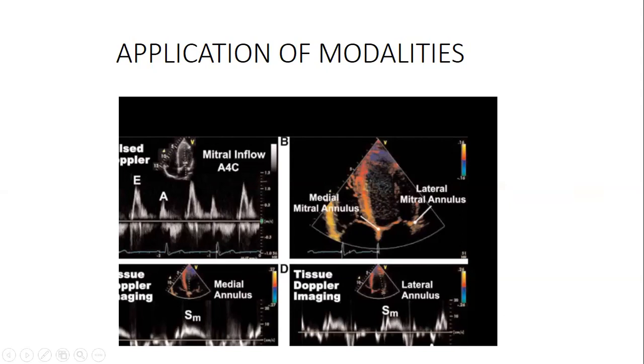This is the maximum velocity that can be determined, or measured, by the pulsed wave. It is determined as half of the PRF, and this limit is called the Nyquist limit. Aliasing occurs if the velocity of blood flow exceeds the Nyquist limit.